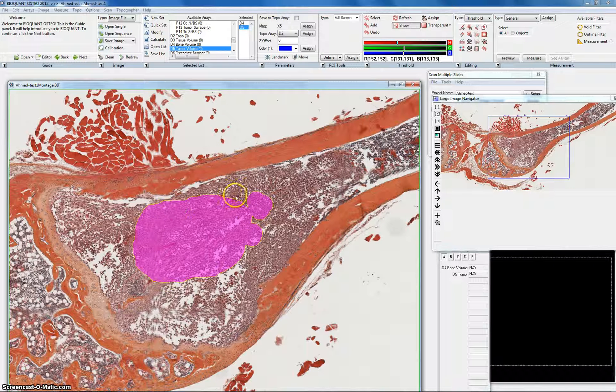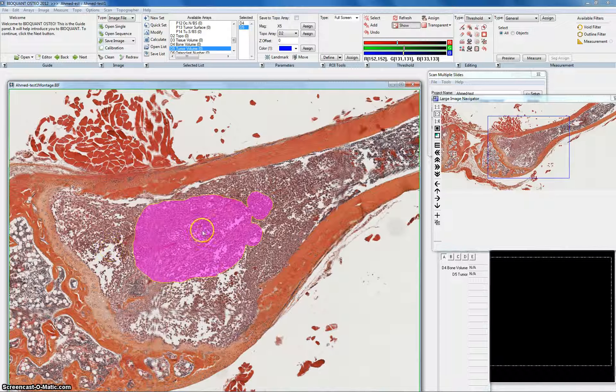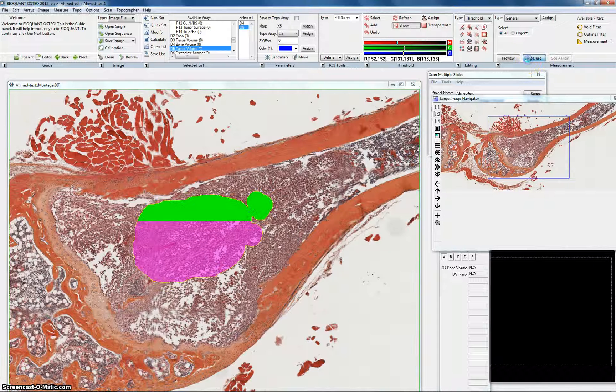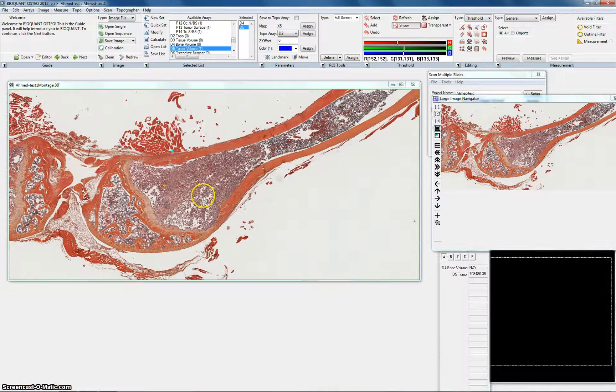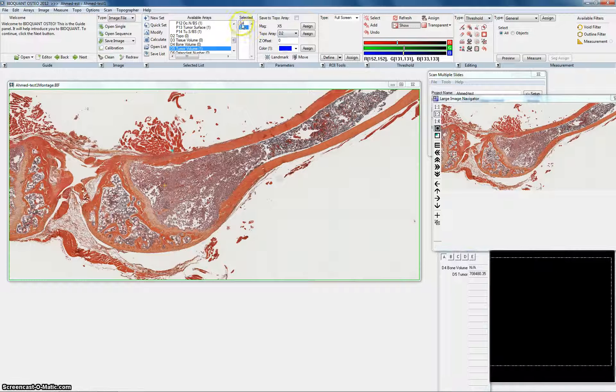Now I chose the area of the tumors that I see. Of course this is all tumors just for educational purposes. And then I hit measure. Now it gives me a number that means that it is measured already. I'm done with the tumor measurements. Now I'll choose the bone volume.